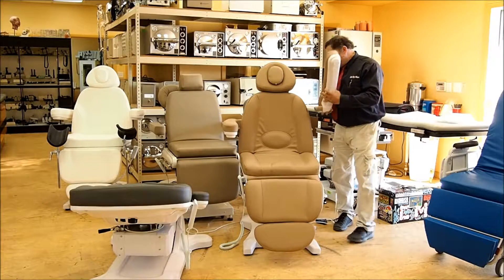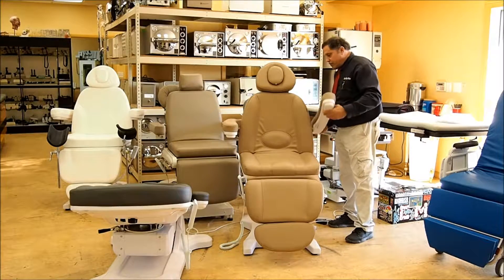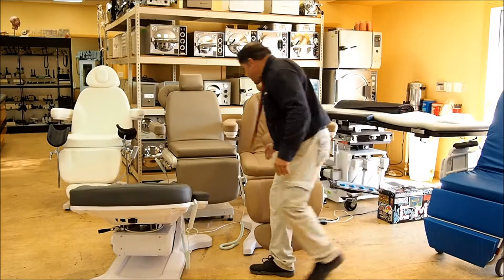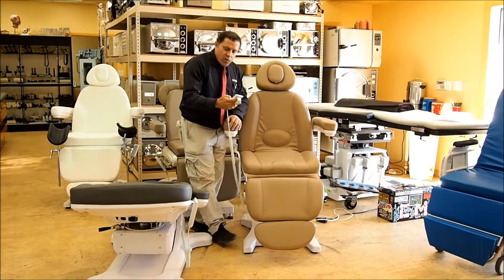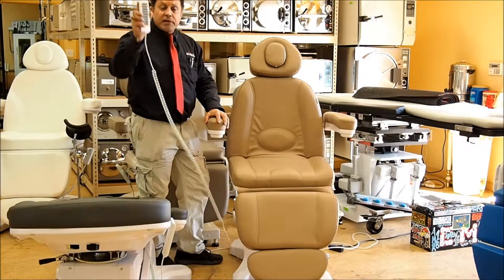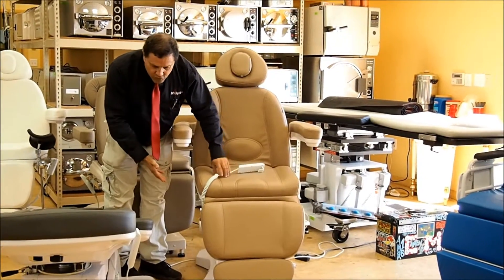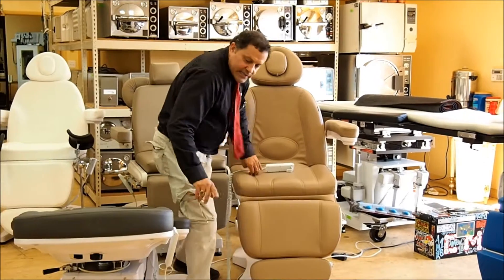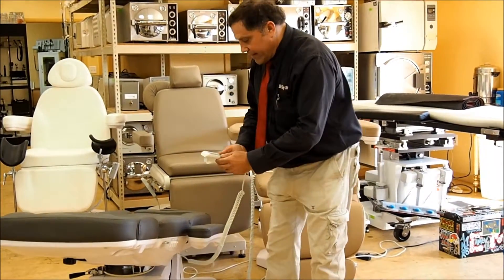We also take your trade-ins. The arms will pop off on the chairs if you'd like. This one features programmability, so you can hit one button and it'll go to any position you want. You have hand control, you've got the option of foot control, and then you've got the side buttons. This one here has got everything.